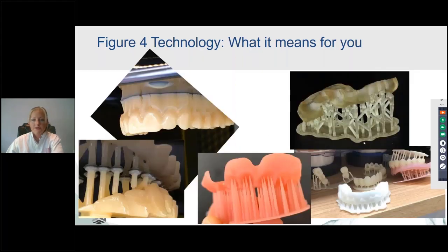Now, this is probably what you guys have all seen too, and you're just like, yeah, this is just a necessary evil of 3D printing. We have to have a lot of supports. We actually don't, okay? So ours are really, really fine, and it's because of that special resin tray and the perforated build platform that we use.